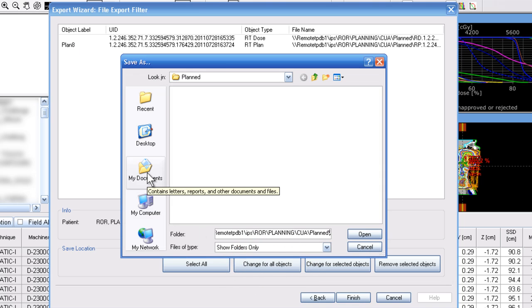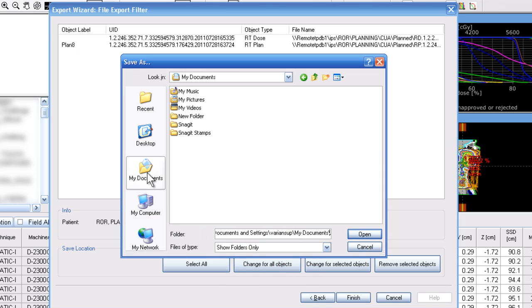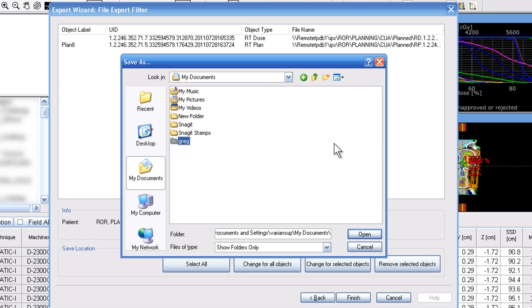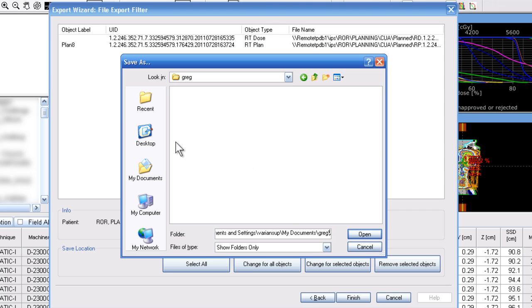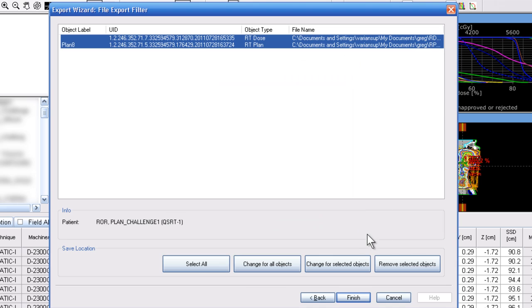We recommend just saving it in your documents folder. From there you can create a new folder called your name, and then double click on that folder and say open.